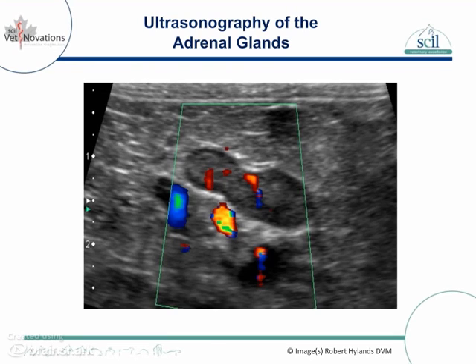We will perform a systematic sonographic approach to the adrenal glands and surrounding vasculature and organs, identifying anatomical features and landmarks that aid in adrenal gland examination and recognition of normal versus abnormal states or conditions. Sonographic features of common adrenal gland pathology will be discussed, supported by ultrasound imaging, and followed by a short set of questions aimed at solidifying the comprehension and understanding of the key elements of adrenal gland pathology and ultrasonography.